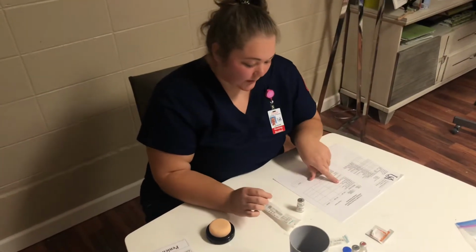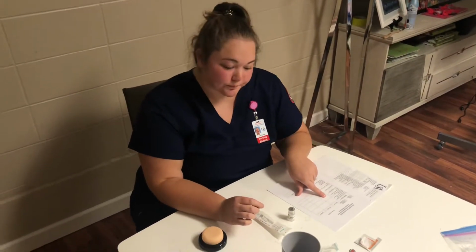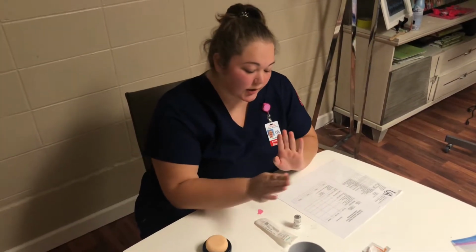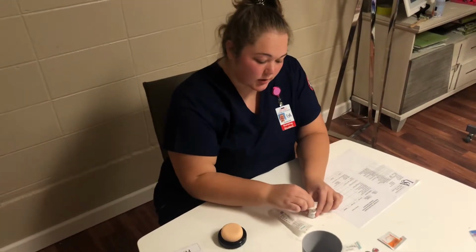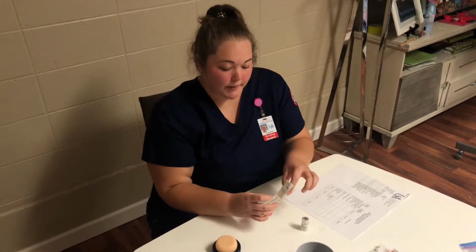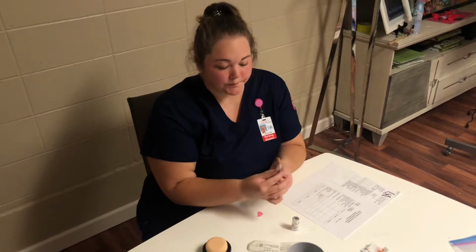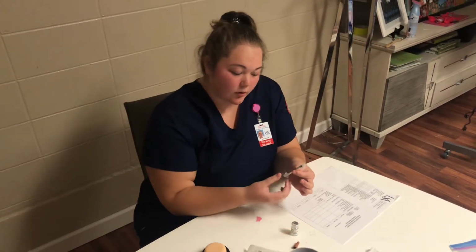And this is to be given every 12 hours. He has not received it today, and he'll be receiving it at 8 a.m. So first, I'm going to clean off my vial of heparin with an alcohol swab. I'm going to open up my syringe and uncap it and leave it on the table.